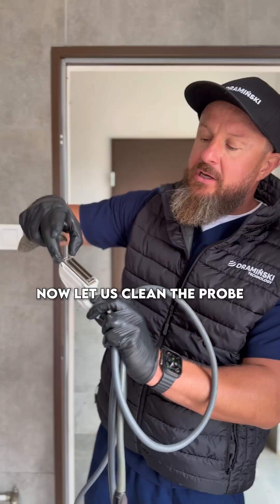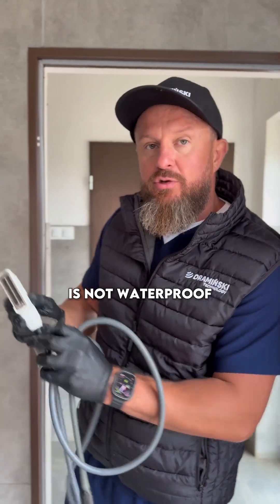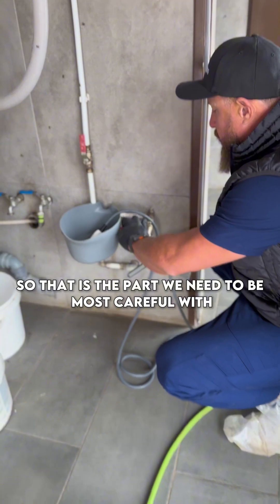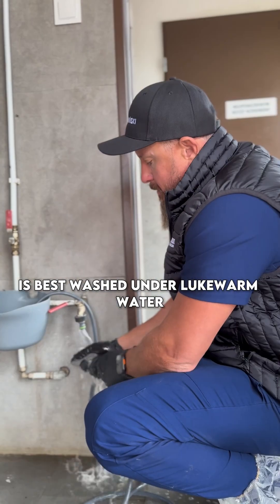Now let us clean the probe. The connector that attaches to the ultrasound machine is not waterproof, so that is the part we need to be most careful with. The part that is waterproof is best washed under lukewarm water.